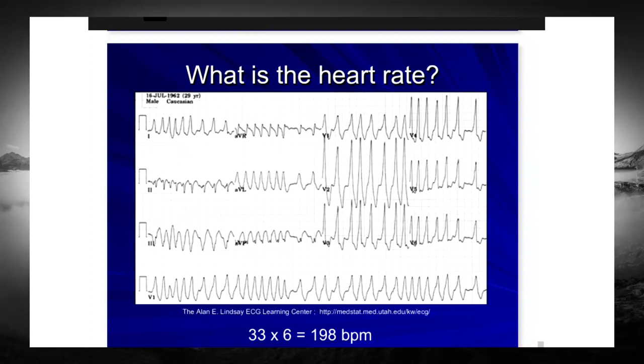I haven't gotten to that yet, but we can talk about it now. This is extremely important. I'll tell you now so I won't forget. When you go around, there are going to be plenty of people who tell you this is the way you have to read ECGs. I do not believe in that at all. I believe whatever way is more comfortable for you, that's the way you do it. You just make sure you do that every single time. That way you won't miss anything.